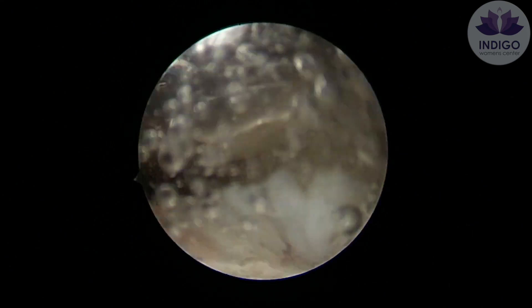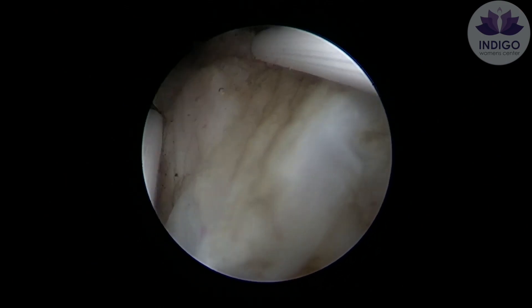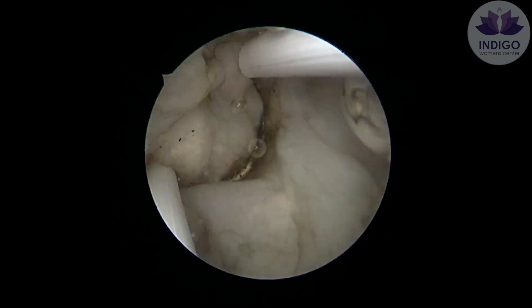Although it can be quite enticing to go and resect out the base of the fibroid, I would suggest you not do that, because the challenge would be to retrieve this fibroid outside the uterine cavity.